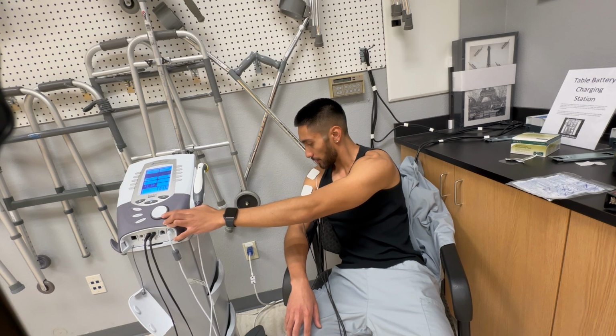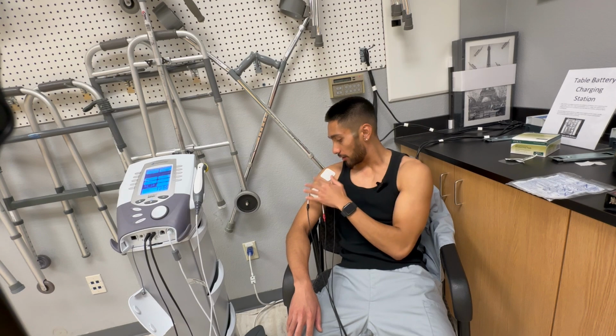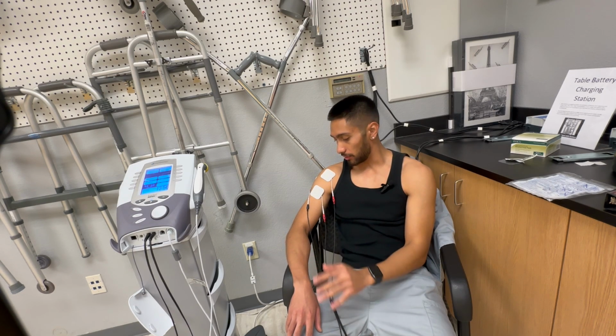So you can see excess muscle twitching in there; mainly I'm just aiming for what's called a tingling sensation.